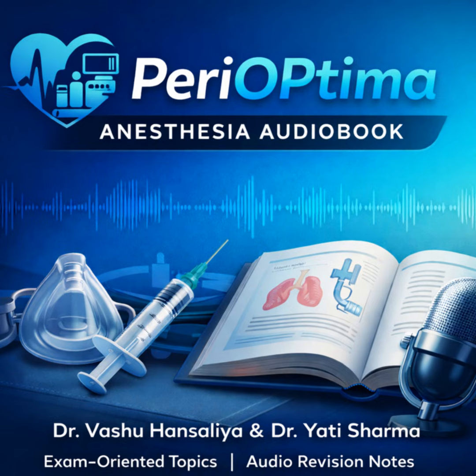And in the other corner, we have the Miller blade, the straight contrast. The Miller is the classic straight blade. It's often preferred for infants and children. Why is that? Because in kids, the epiglottis is floppier and it sits higher up, more cephalad, so it's often easier to just go under it and lift it directly. The Miller is also useful in adults who have a particularly long, floppy epiglottis. And the common adult size? A Miller size 2 is what you'll most commonly see used in adults.